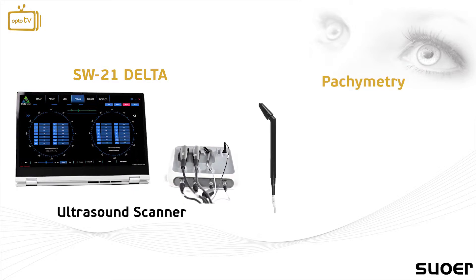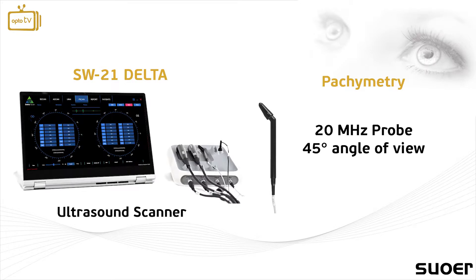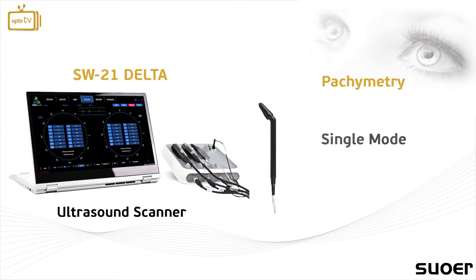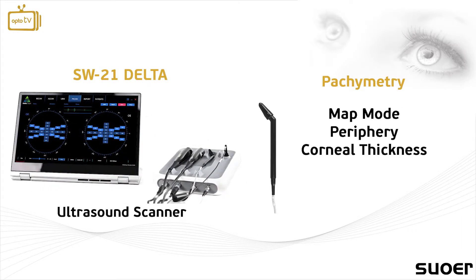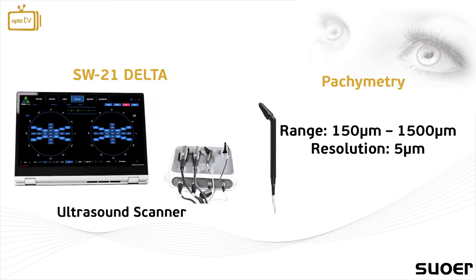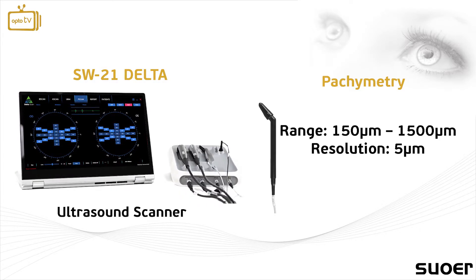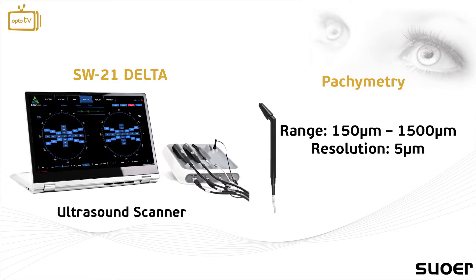The pachymetry has a 20 MHz probe with a 45-degree angle of view. It allows the user through its display modes to choose single mode for specific analysis or map mode for periphery and corneal thickness measurements, which can also be used for IOL calculations. The range of measurement is from 150 to 1500 micrometers with a measurement resolution of 5 micrometers.